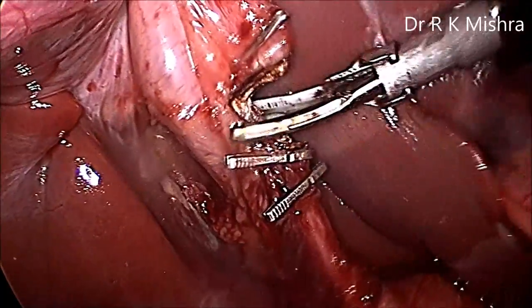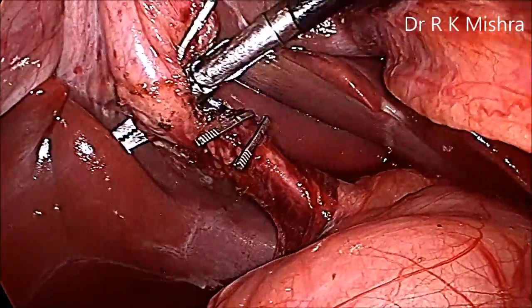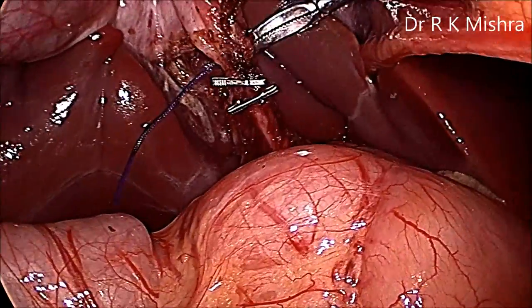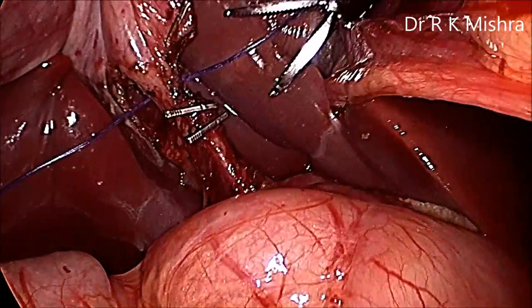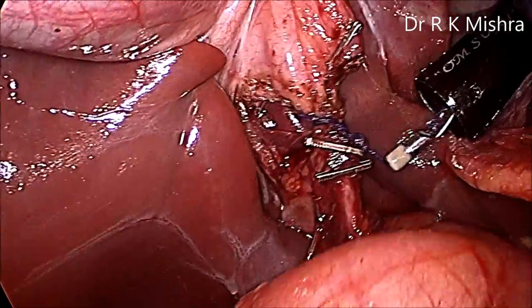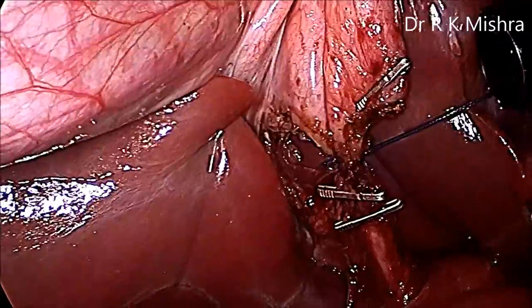For the cystic duct, the choice is yours; here we have chosen an extracorporeal knot. You go from behind and then tie it. We will use Misra's knot — an extracorporeal knot has the advantage that there will be no clip stone; the delayed complication of cystic duct clip stone can be avoided, especially in pediatric cases. This is Misra's knot; the configuration is one-one-one-one-one. The cystic duct is nicely ligated and then cut with scissors.